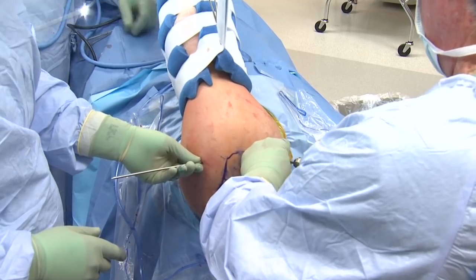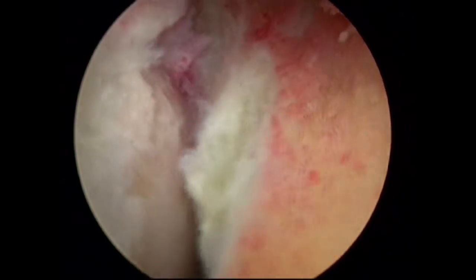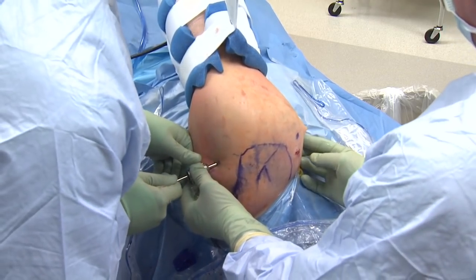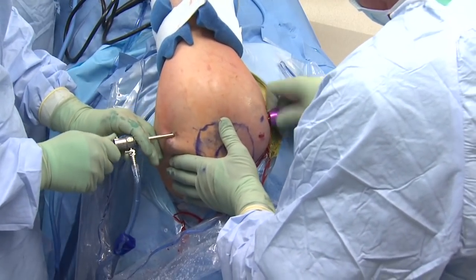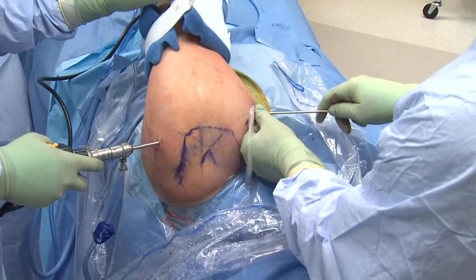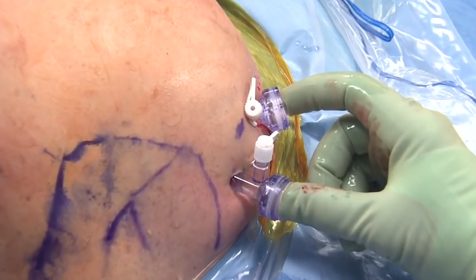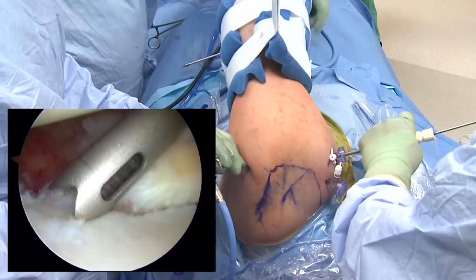Here we're looking at the front to demonstrate the anterior Bankart lesion and the anterior bone which we've decorticated — you can see we're ready to do the repair. We need to establish another portal at the front; it can be done from outside in or inside out. Here we're doing it from inside out by passing a device over top of our Wissinger rod and dilating it up to insert a cannula, balancing the scope and cannula to make sure they both stay in the joint. We now have two portals and two cannulas coming in, both in the interval, and we're prepared with our two-portal technique.